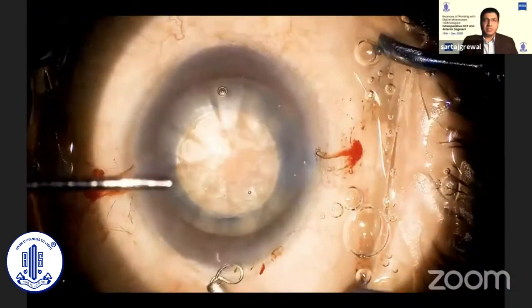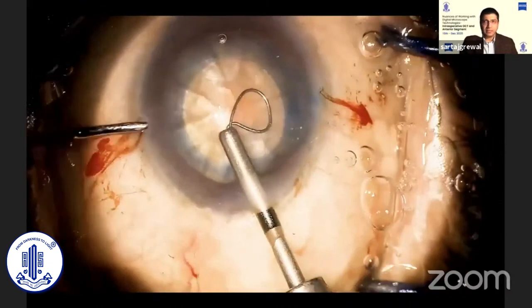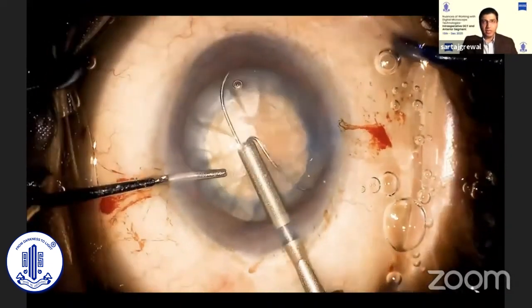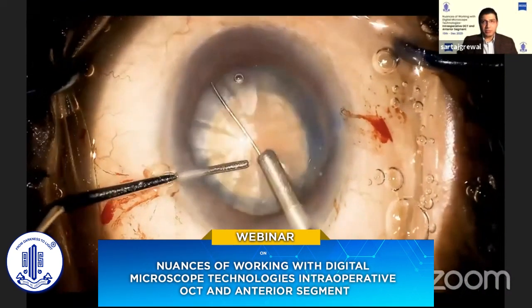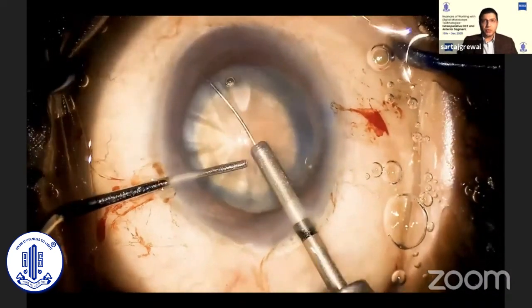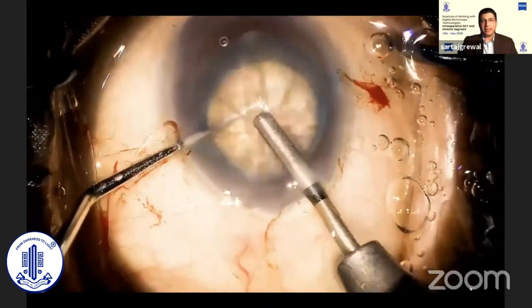The instrument is to be inserted with the loop oriented in the coronal plane. The edge of the capsule is gently tented up with the loop, and slowly the loop is expanded. Once the loop reaches the equator of the capsule, you gently rotate your hand clockwise, orienting the loop vertically in the sagittal plane, and then retract.